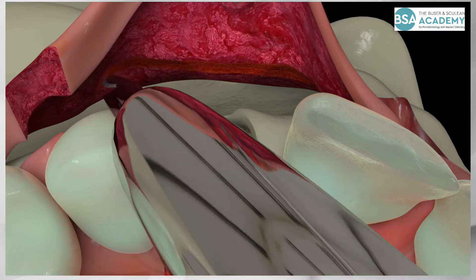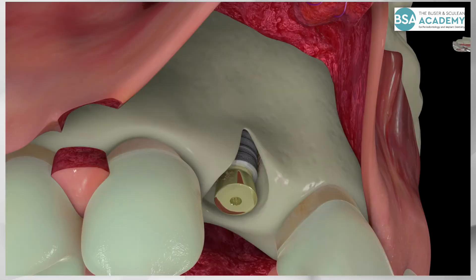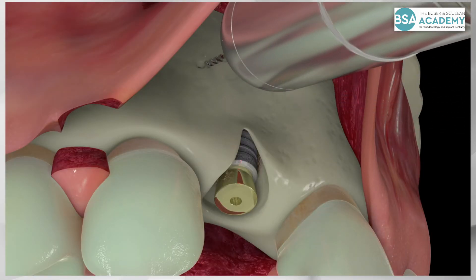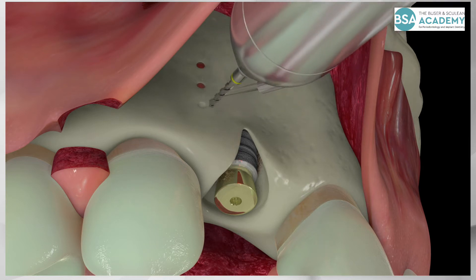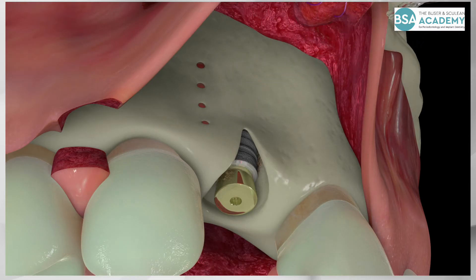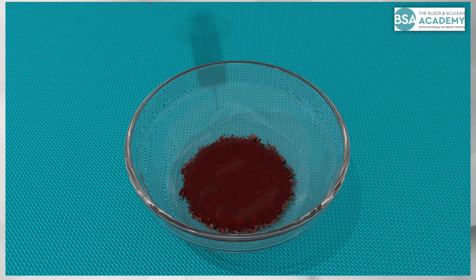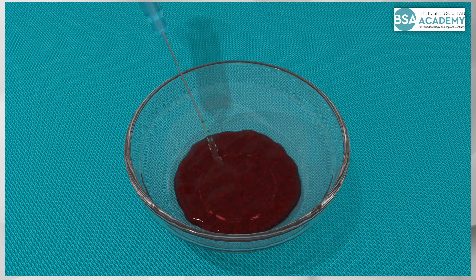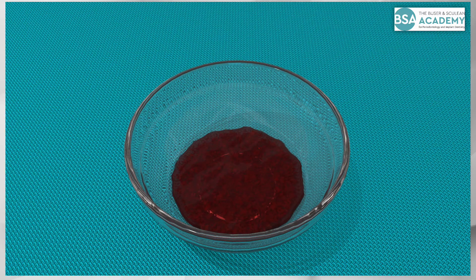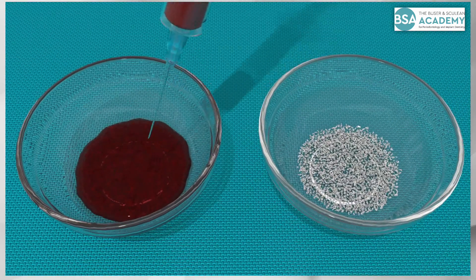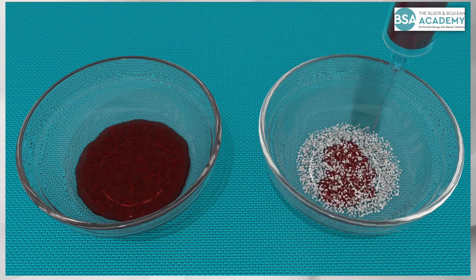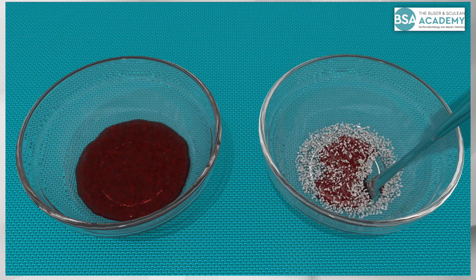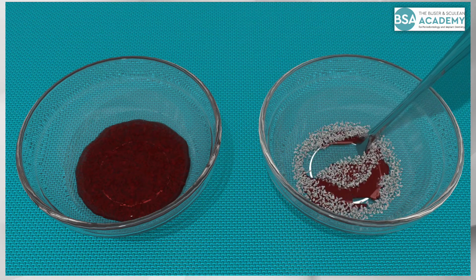An incision of the periosteum is done to mobilize the flap for tension-free wound closure. Small boreholes are applied in the cortical bone surface to open the marrow cavity and allow some bleeding on the facial aspect. The blood in the sterile dish is diluted with some sterile saline to increase the volume of the bone-conditioned medium. The medium is used to moisten the bovine bone filler, which has a low substitution rate. The bone-conditioned medium contains proteins and growth factors which are absorbed by the bone filler particles.